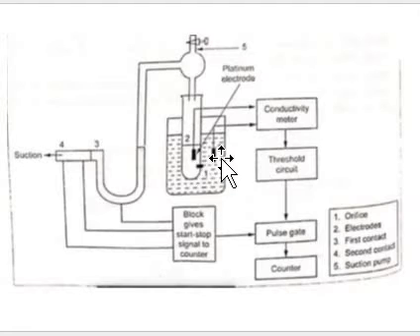Due to this pressure, the liquid will be allowed through this test tube through the small hole. Whenever any blood cell passes through the hole, the conduction between the 2 electrodes stops. Later it starts again, and when another cell passes, it stops the conduction. I will show you a small video related to this so that you can understand clearly. Just a moment.